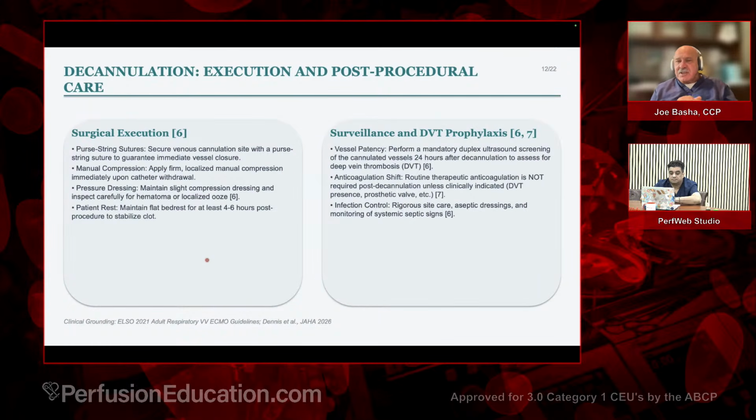Decannulation, post-procedural, you want very close surveillance and DVT prophylaxis. And of course, if you have to close anything, usually with VV ECMO, you rarely have any significant bleeding.